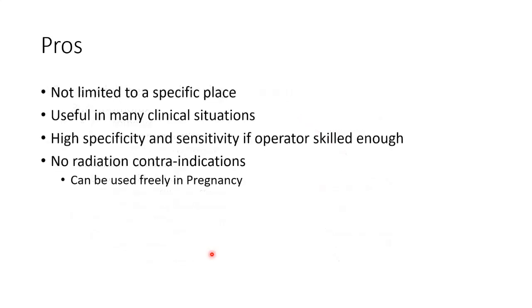Okay. So what are the specific pros of ultrasound? It's not limited to a specific place. If you want to do an ultrasound in an open field with a generator, you're perfectly welcome. You can do an ultrasound in ICU, you can do an ultrasound in the ward, literally anywhere. It's useful in so many clinical situations, not just the emergency department. The renal departments use it so often. ICU uses it. Even in an outpatient setting, you can use it for so many things. Obs and gynae goes without saying.